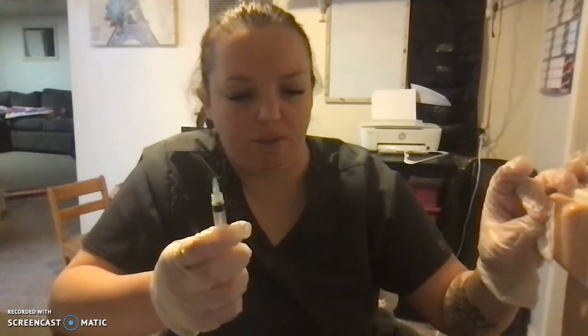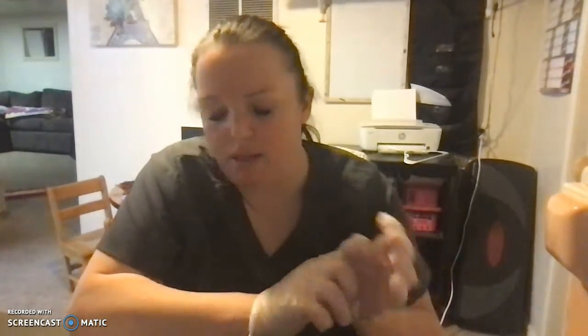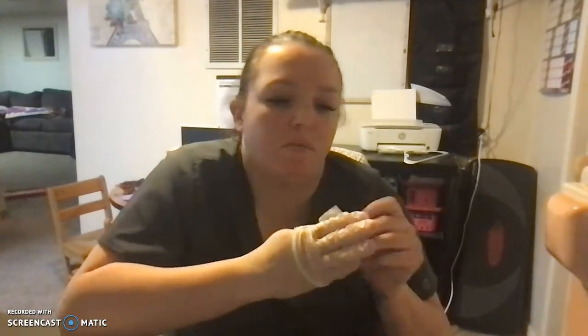I'd activate the safety. Of course, this one doesn't have one. And then I would dispose in the sharps container. Make sure there's no bleeding, make sure my patient's okay. And then I would remove my gloves, get rid of my mess, perform hand hygiene, and document the procedure.